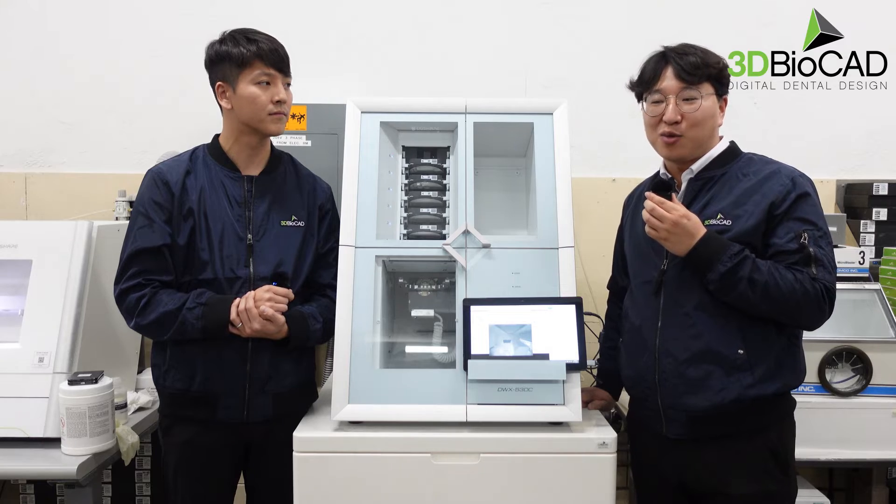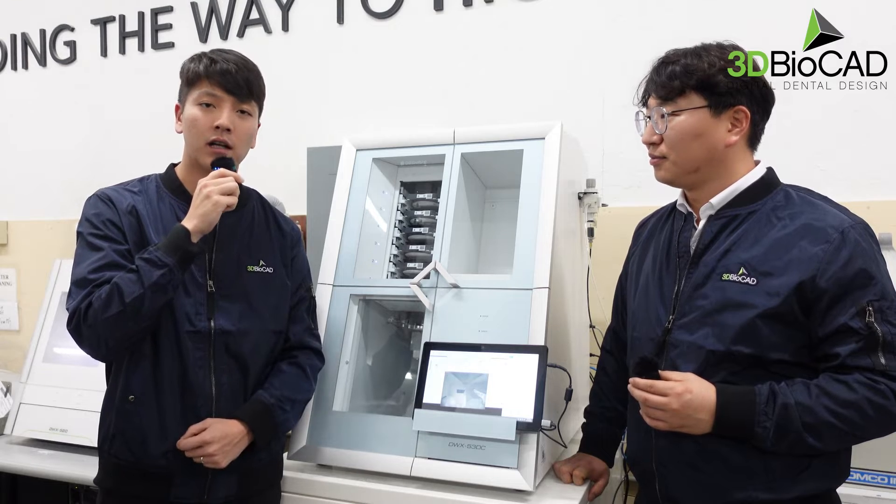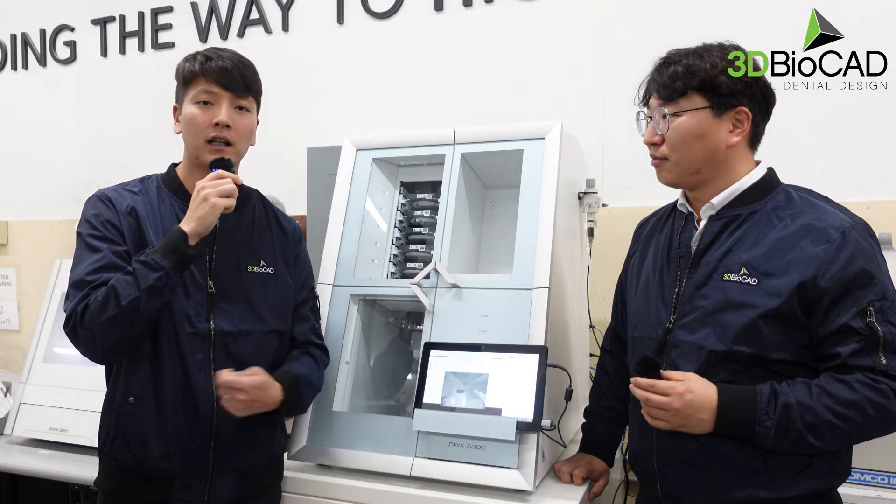For more benefits and good points with this machine — Roland has become bigger and stronger. The biggest difference from the 52D is that the 53DC uses a bigger spindle and a four-millimeter thicker milling burr, which maximizes milling time for dental milling centers and clinics.